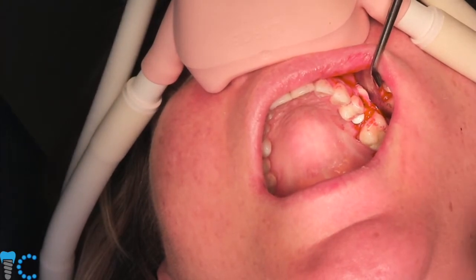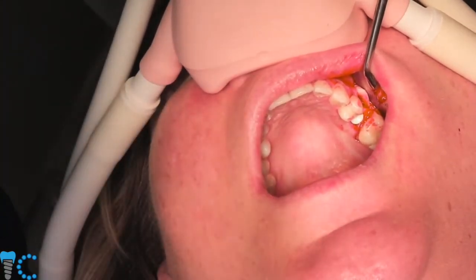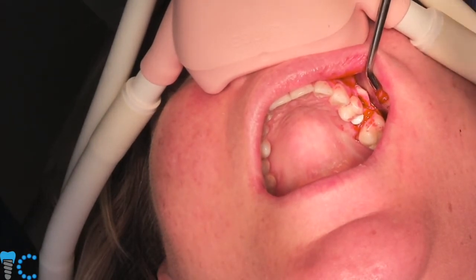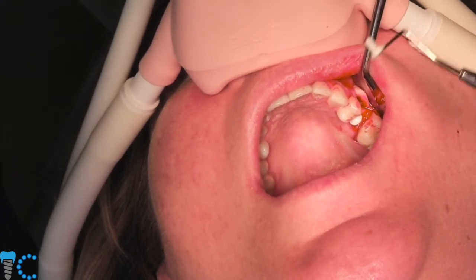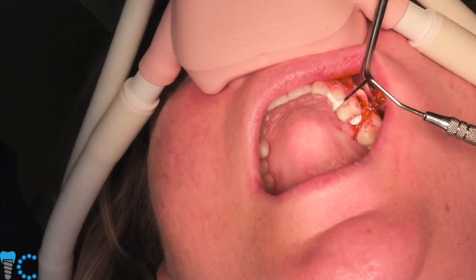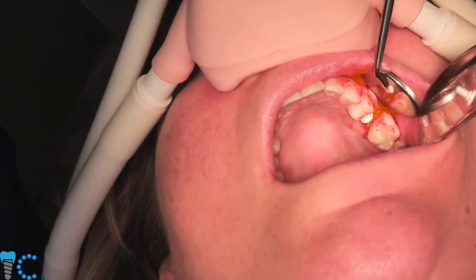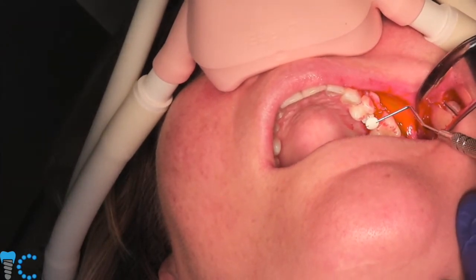If we just put this in our fingers, it's really difficult to get it seated. If we use the explorer end of this instrument, it's too skinny, it spins around, but the perioprobe is just perfect. You can see I have absolute stable grip of this thing, and then placing this should be a piece of cake. Even I can do it.